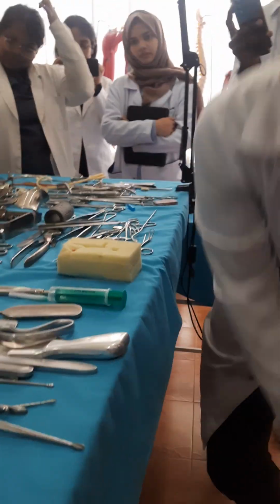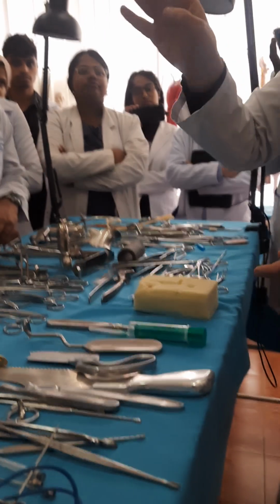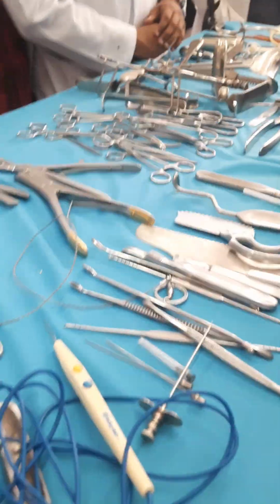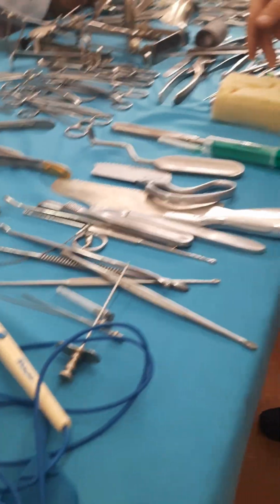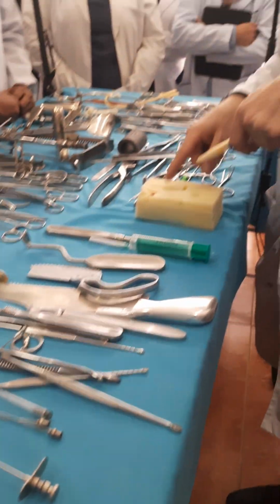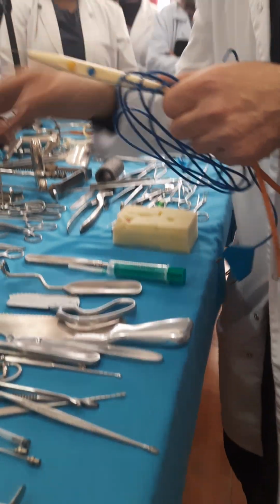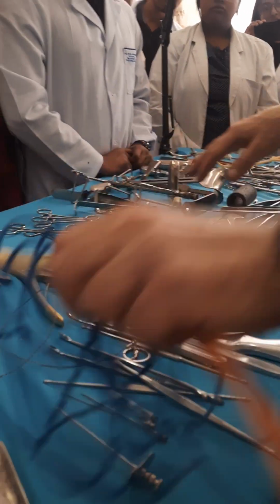Now look, remember please, there are 4 methods of arresting bleeding. And this group can be used, method number 1, temporarily inside of the wound. Method number 2, permanently inside of the wound. Then you make coagulation. Let's say this instrument, I say, is included in both groups.